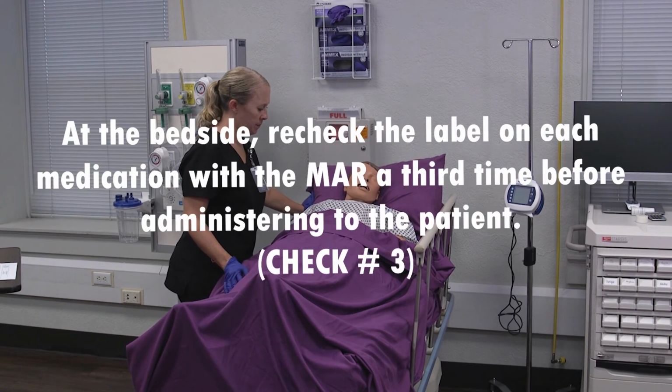At the bedside, recheck the label on each medication with the MAR a third time before administering to the patient.